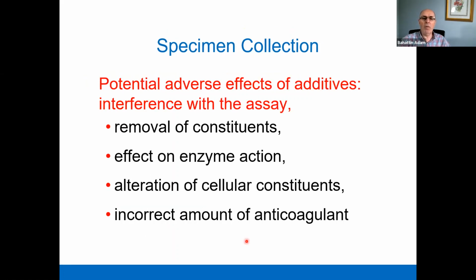Now, however, such kinds of anticoagulants or additives have some interferences with the assays, with the lab tests. We need to consider what kind of adverse effect the anticoagulants or additives have, and which tests will be affected by such additives.